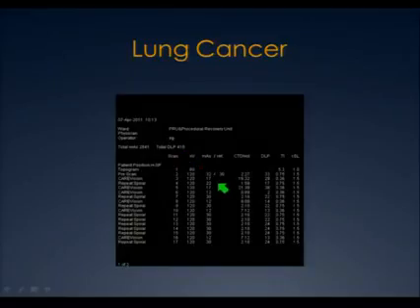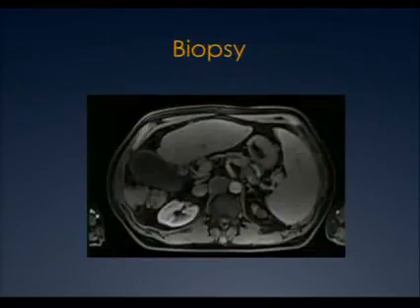Why? Because I used low mAs. 17 is about as low as I can go, but I try to use as low as possible all the time. You can see the tumor, you can get the job done, and you deliver a reasonably low dose.